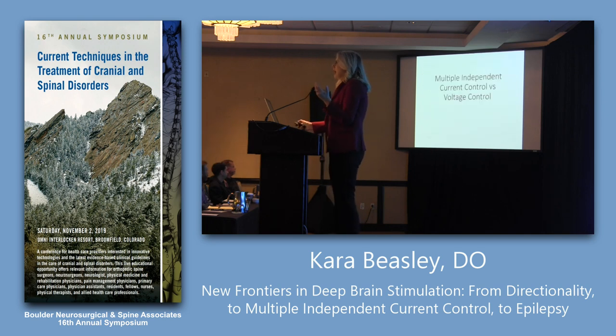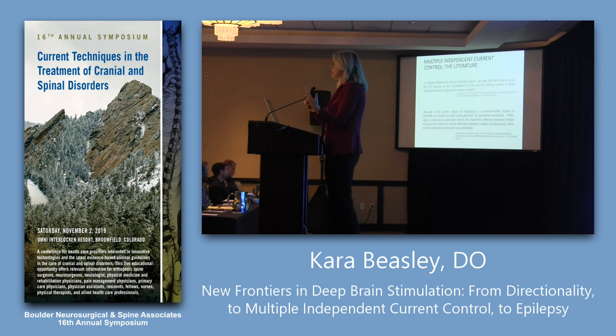So that's directionality. And both of these companies have directionality. And I'm not even going to name the companies. I don't really care who the companies are. What I want to talk to you about is the science. There is a special advancement within directionality that is really what I feel like is the game changer. Everybody was excited about directionality, but really the game changer is what's called multiple independent current control, versus voltage control. So I'm going to tell you.